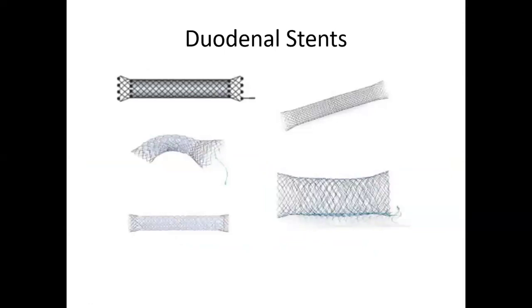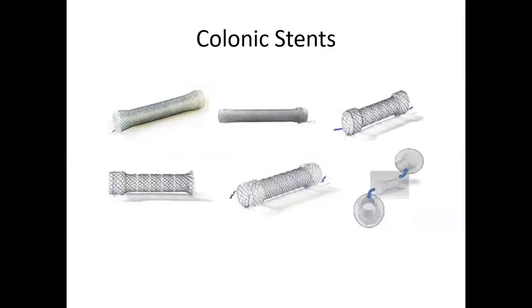The same applies to patients with pancreatic pseudocysts. We can create a fistula between the stomach and the pancreas and drain the cyst using a stent, but there are different stents that we can use, not these ones. These ones are for the duodenum. These are the colonic stents.